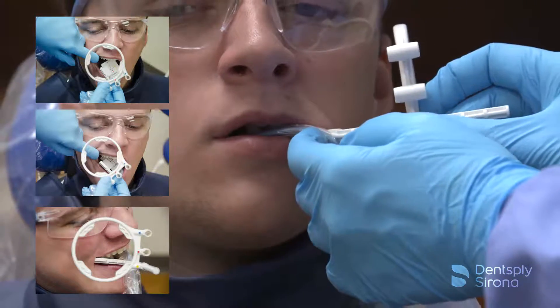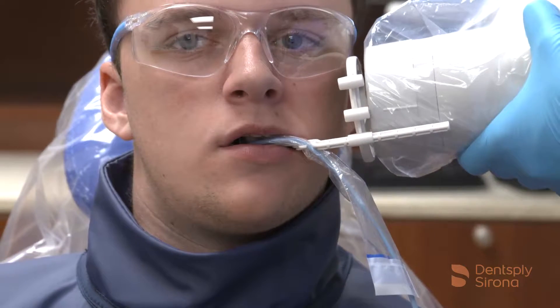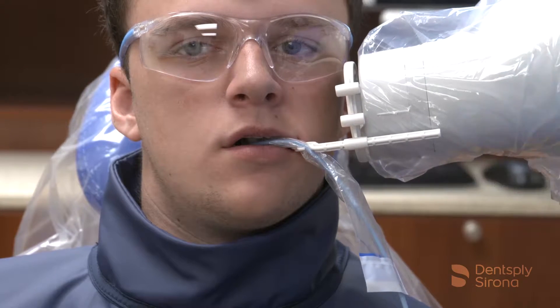Once the bite block is in place, slide the aiming ring down the arm close to the patient's face. Align the tube head of the x-ray unit in close approximation to the aiming ring and center it. The x-ray image is now ready to be captured.